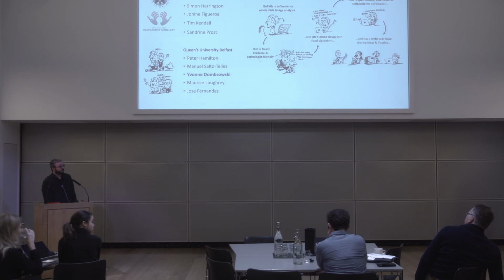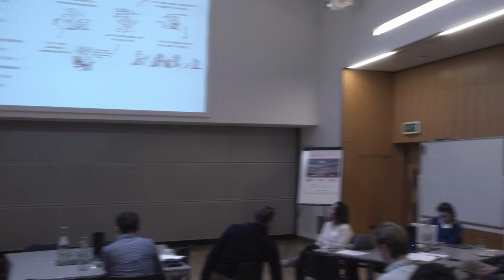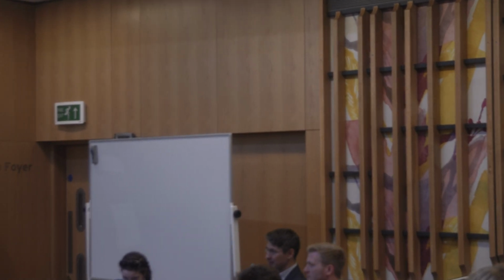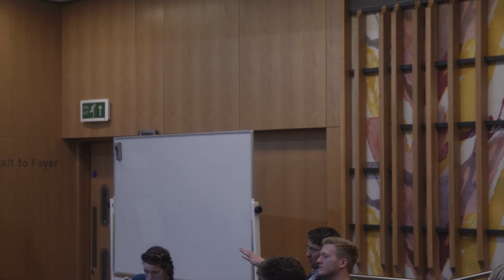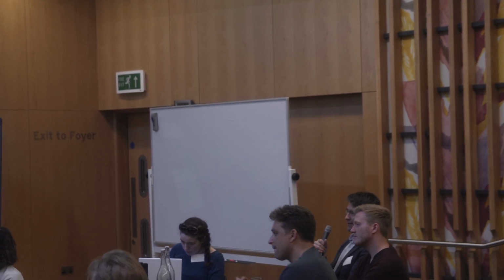Hiya. I would also like to thank you very much for the talk. I am from a genomics background and not from an imaging analysis background. But I do think that the two fields evolve towards each other, and from the genomics background, people would call it spatial transcriptomics, right? And I would like to ask you, could you delineate, is there a difference between what you call multi-channel image analysis and what genomics people call spatial transcriptomics?